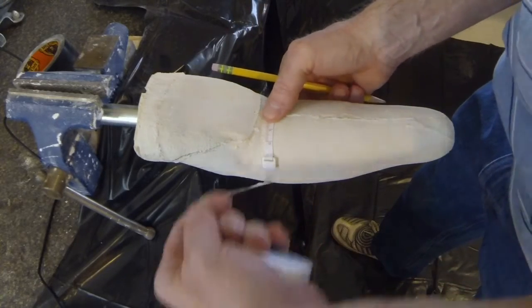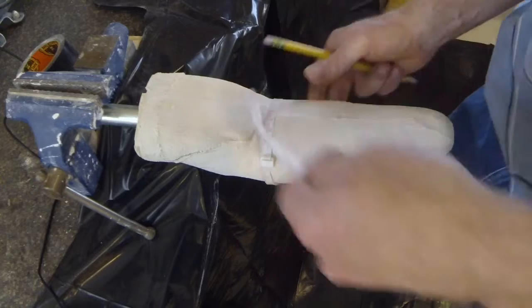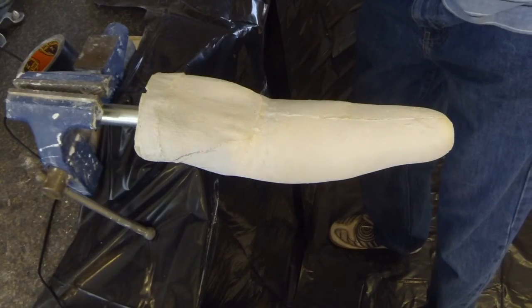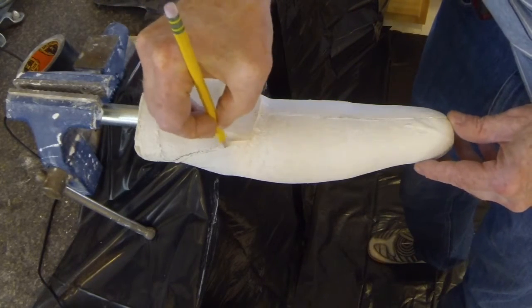It is sometimes useful to take a circumference measurement at the antecubital fold during casting. If that was done, this measurement can be checked on the positive model and the cast modified to match the anatomical measurement. The anterior wall should fit directly into the antecubital fold.